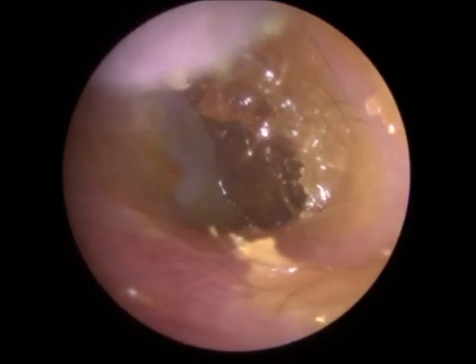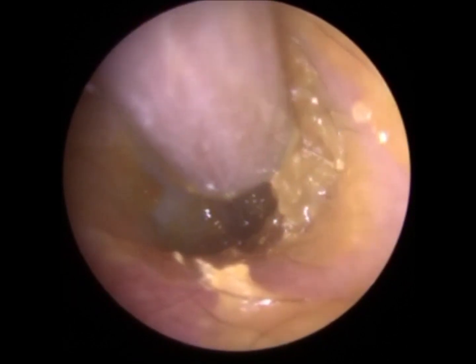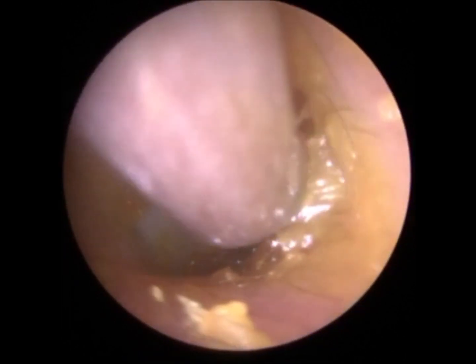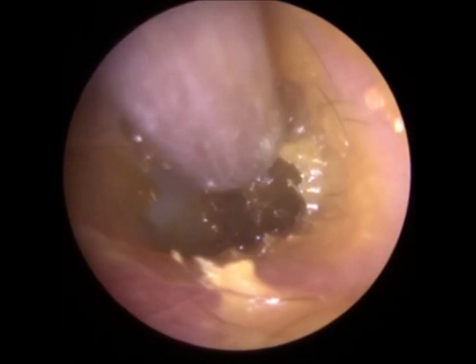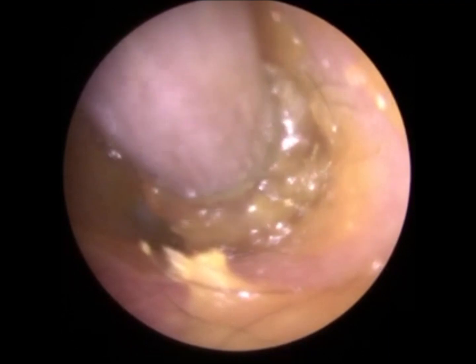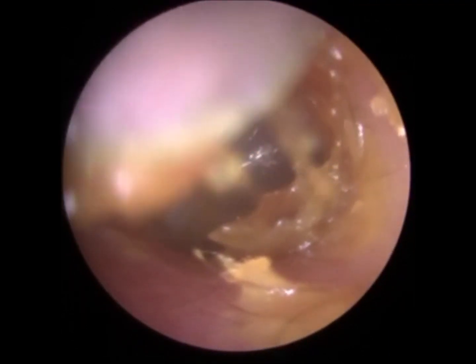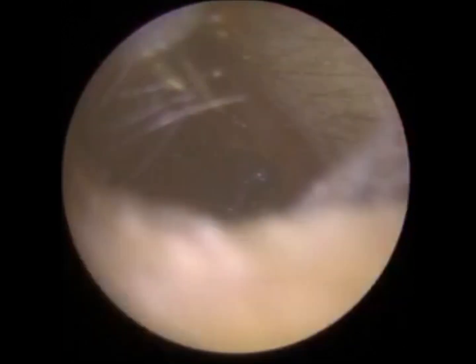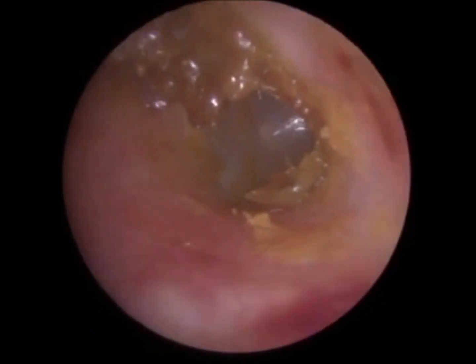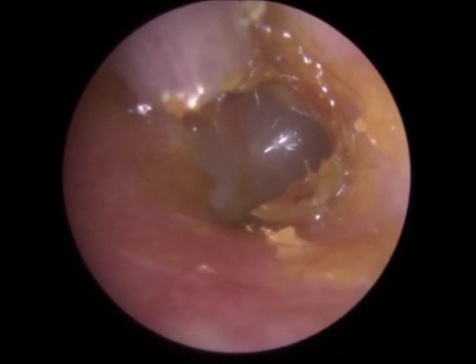Just block the wax and then it can go off again. We're not trying to get every little speck of wax out — by doing so we can cause more trauma. We'll get it blocked out. It's quite wet around the edges; we're going to leave all that, that'll dry up.